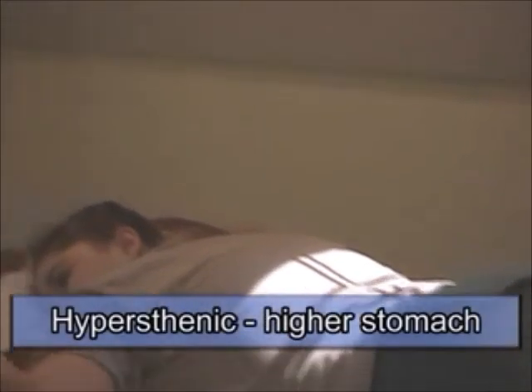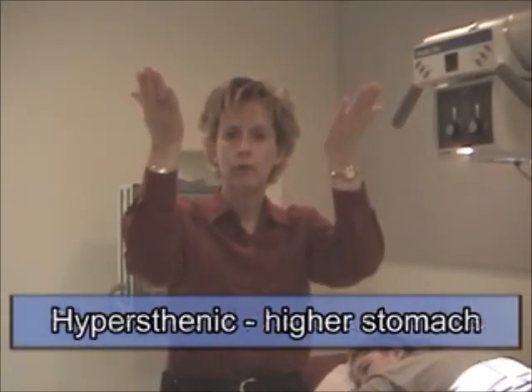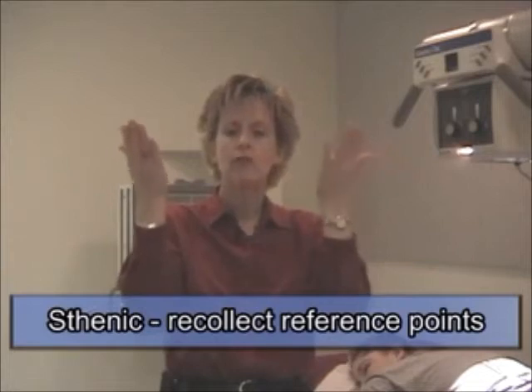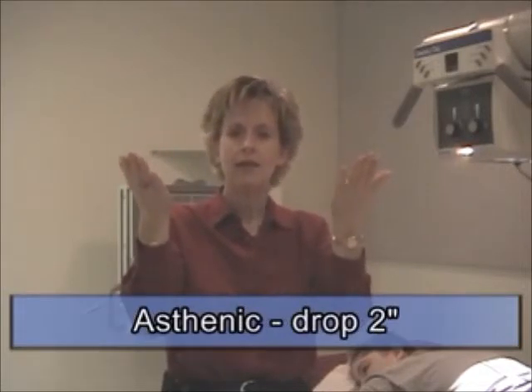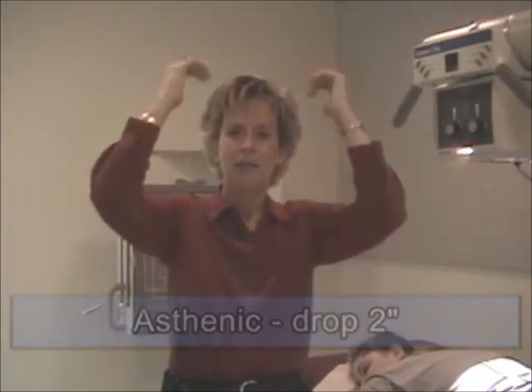Okay. So, hypersthenic patient, the stomach is higher, center a little higher than normal. Sthenic, we're making you memorize those part film reference points for the sthenic patient. Hyposthenic, just under average, so you drop down 1 inch, and asthenic, you actually drop down 2 inches. Okay? Hypersthenic, hypo, and asthenic in 1 inch increments for the different body habitus.